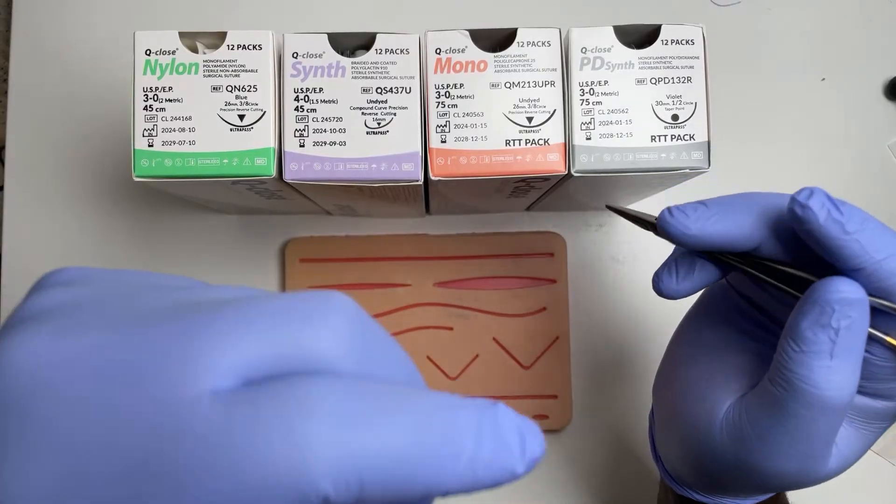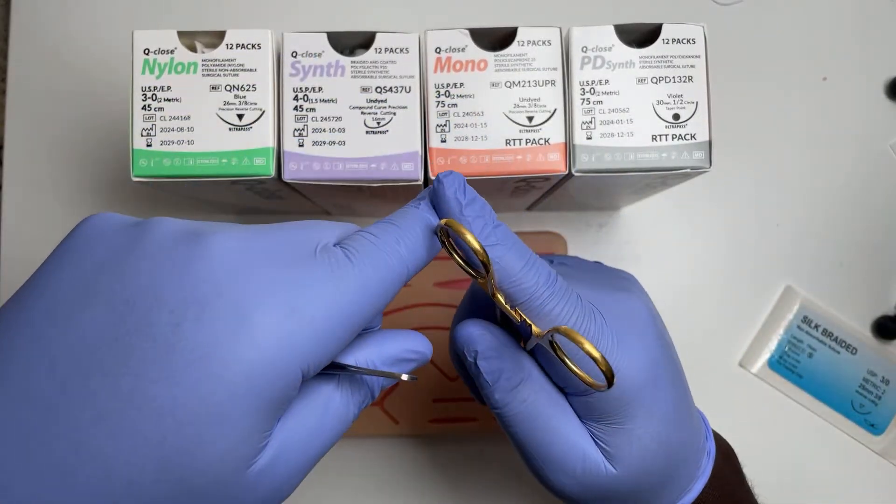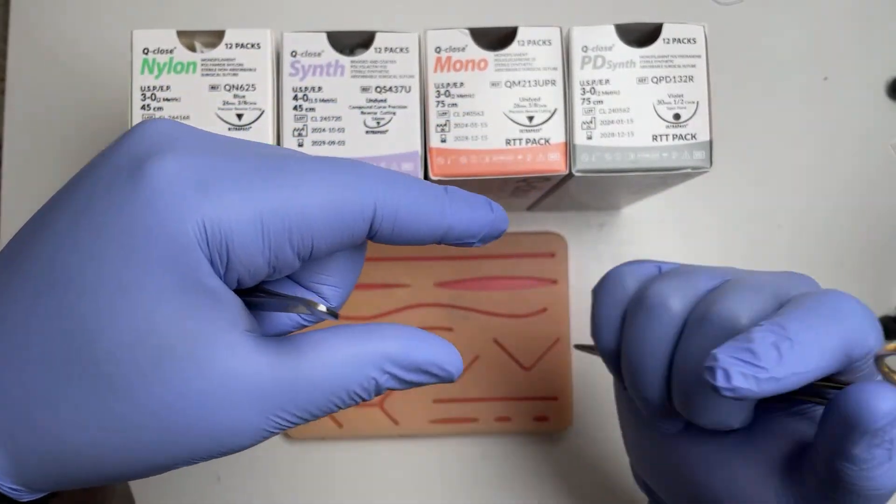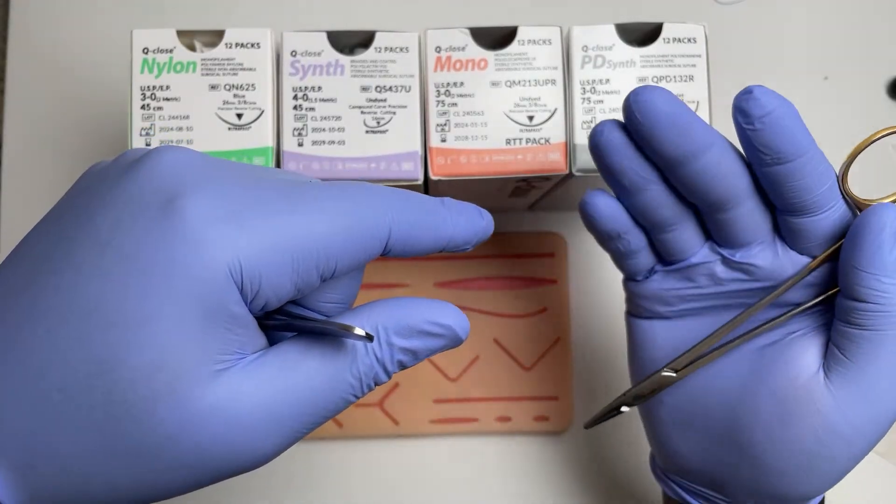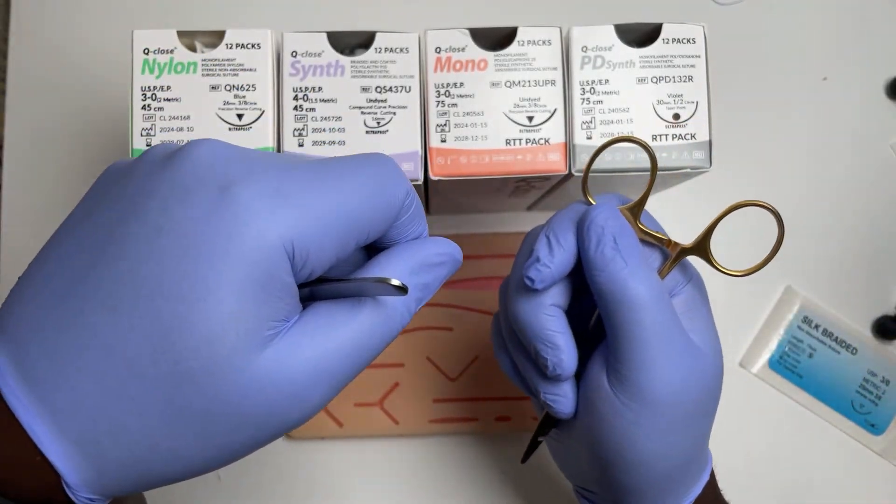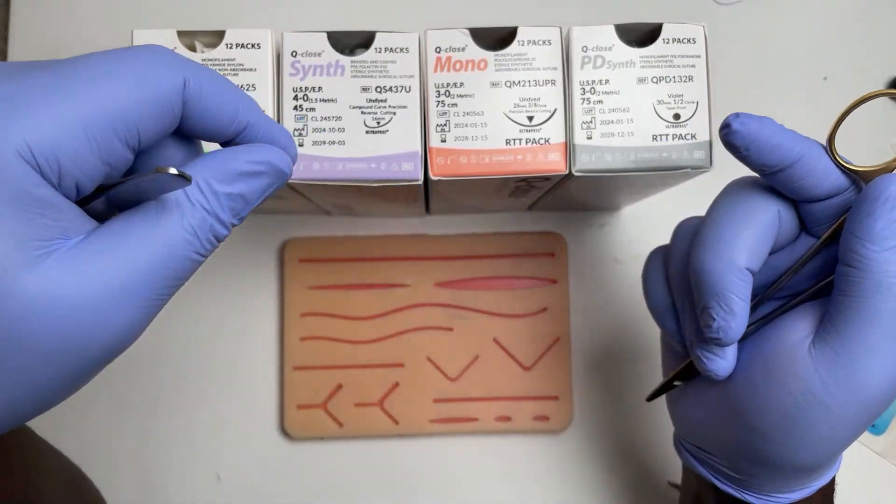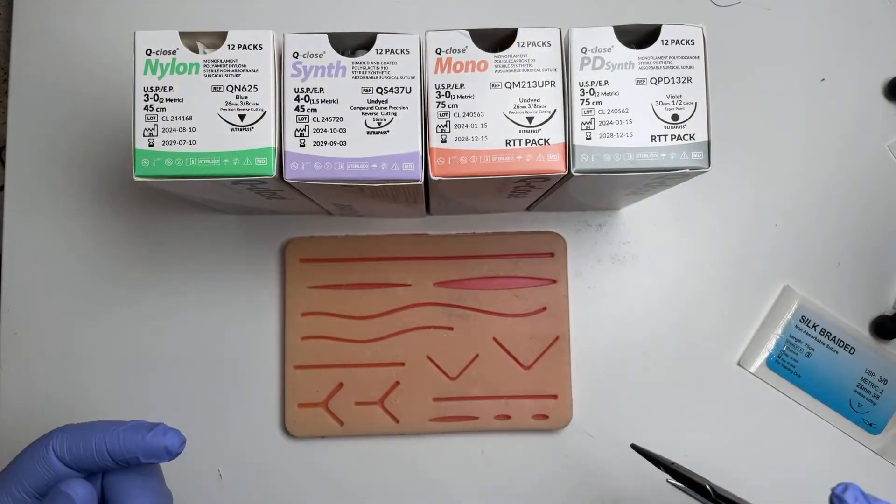When you've got skin, the really elderly or the really young, the dermis is really thin, the second layer. I prefer to use a braided suture because it has better grip, so less likely to rip out and cheese wire through.